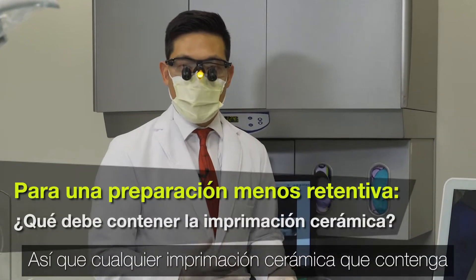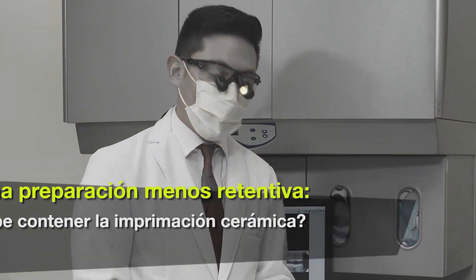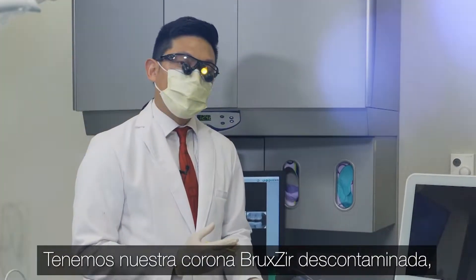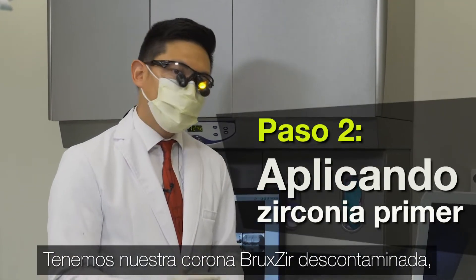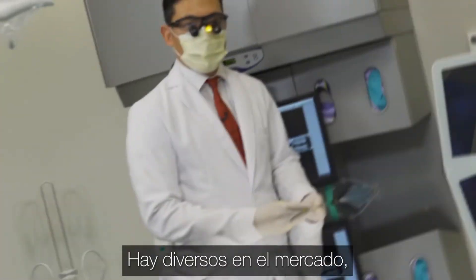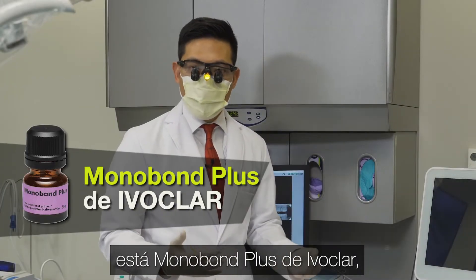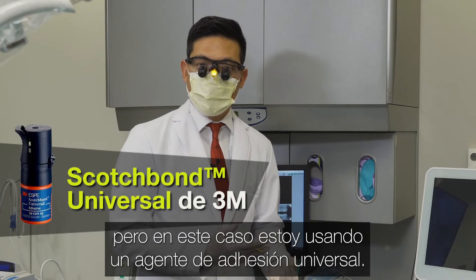Any primer, ceramic primer, that contains MDP is the key whenever you're bonding zirconia. So we have our decontaminated BruxZir crown. Now we're going to follow it up with a zirconia primer. There are several on the market — Z-Prime by Bisco, Monobond Plus by Ivoclar. In this case, I'm using a universal bonding agent.